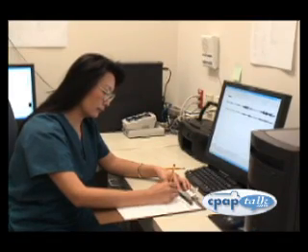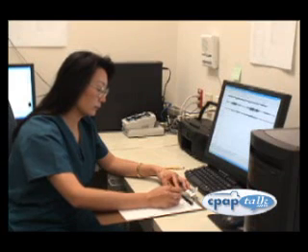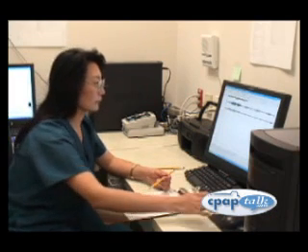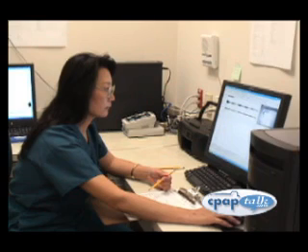Sleep studies are done by sleep technicians, or sleep techs. Their job is to make your stay as comfortable as possible while gathering the information needed by your doctor. The sleep tech will be monitoring your sleep from a separate room and will do as little to interrupt your sleep as possible. Sleep techs want you to be confident and comfortable, so please bring any questions or concerns to their attention.